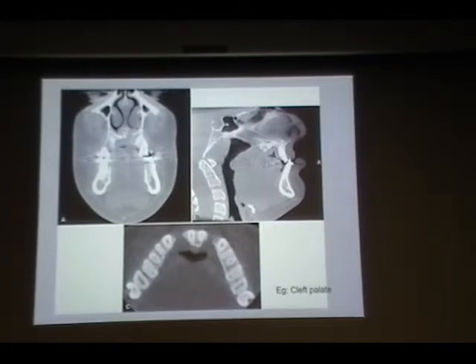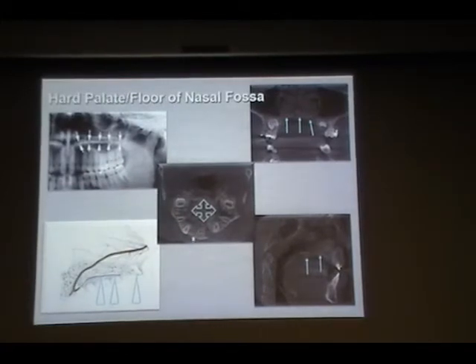So if you compare this image here with this one, you can see the teeth are present and there is no breach.